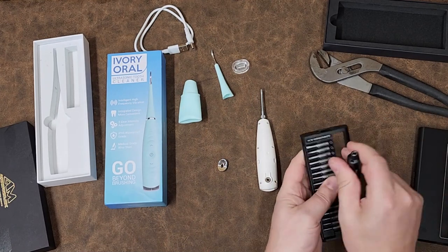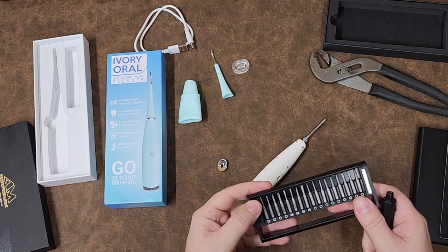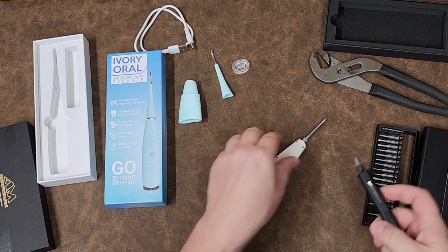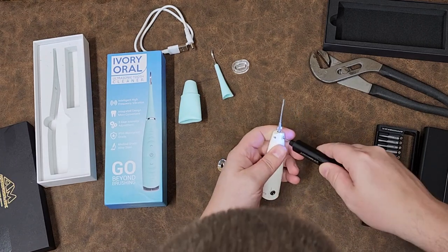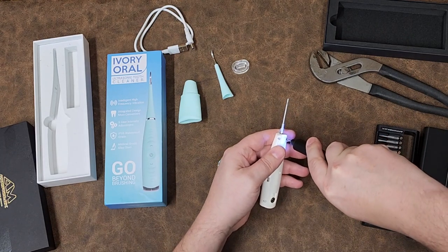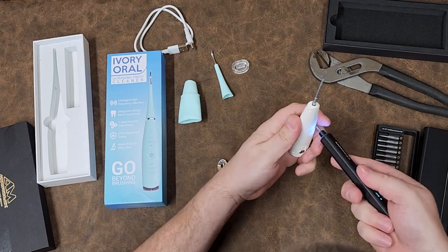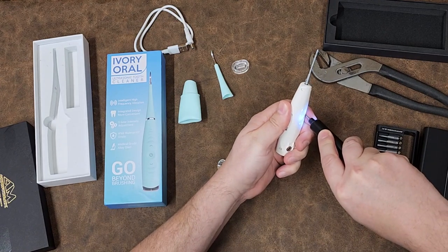This looks like a PH 00 Phillips. No problems at all. This is the kind of work that this screwdriver was really designed for — light duty, where you need light amounts of torque because you don't want to booger up these fasteners.